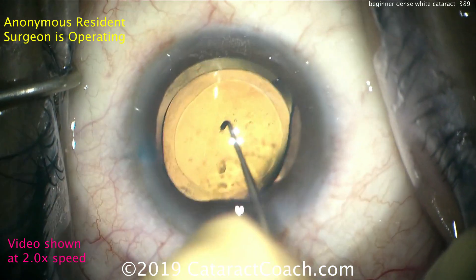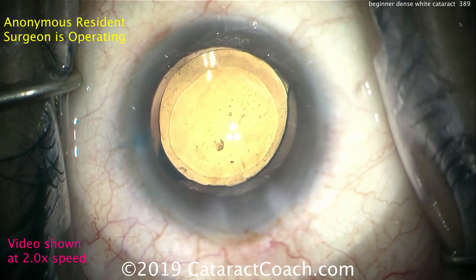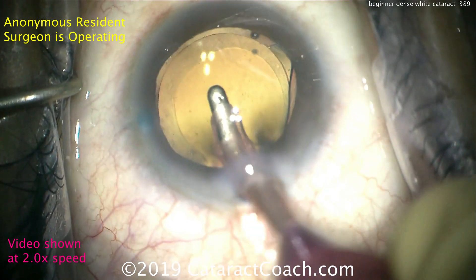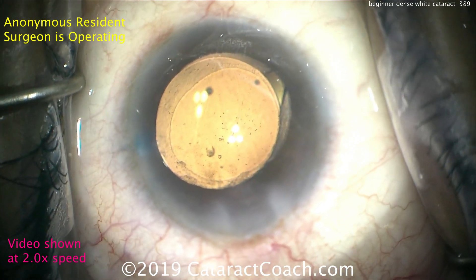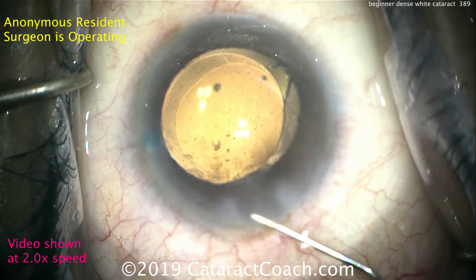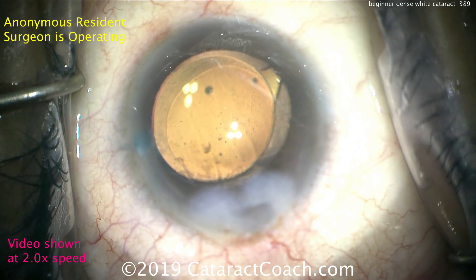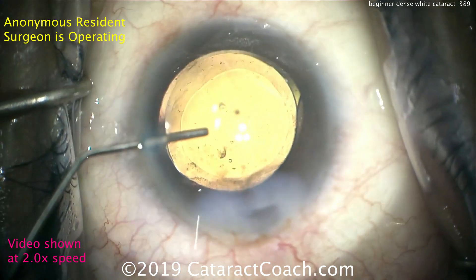Time to remove viscoelastic. I like to go behind the IOL to remove viscoelastic thoroughly. In beginning surgeon cases, that's not absolutely necessary — you can tilt the lens in different meridians to help remove it. There still appears to be some particulate matter; I'd prefer a more thorough job removing that. For incision hydration, I'm not a fan of these large white spots of side hydration — you can hydrate a little bit less than that. There may still be some retained viscoelastic, but it's a beautiful case.